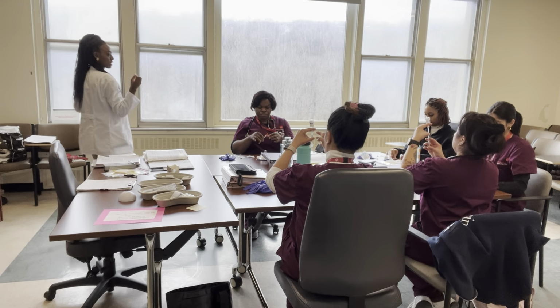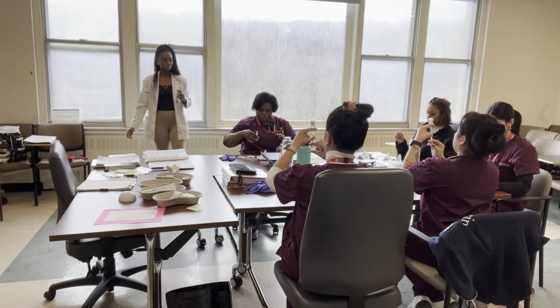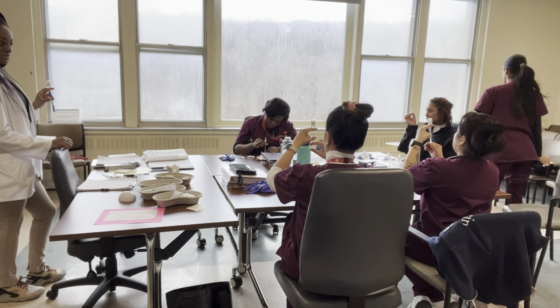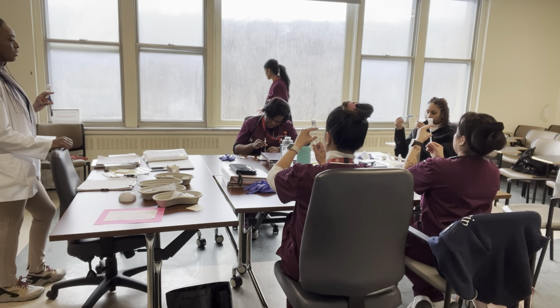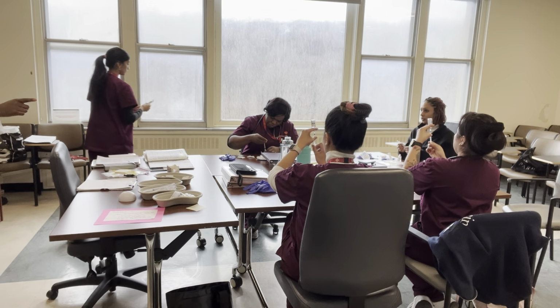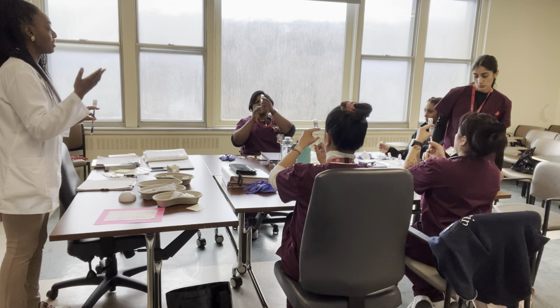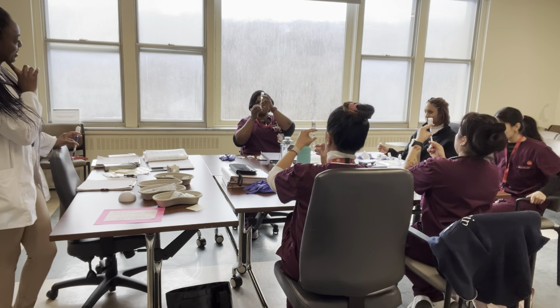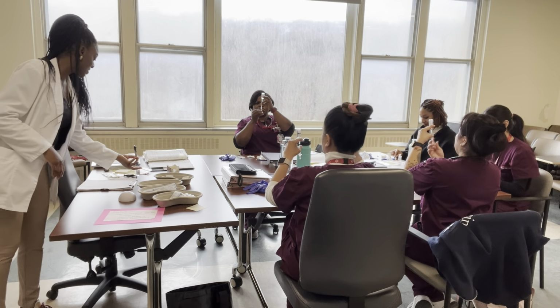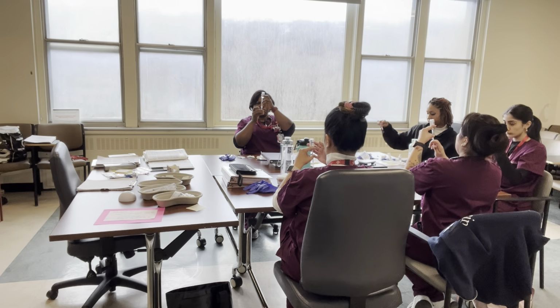So again, you'll practice the walking with it, and you put it away here. When you're done, leave it inside, darling. Remember, I have to verify. Anna had to verify it, because now it doesn't count. You could have taken it from any vial. Now you dropped it. Can you reuse the needle when you've dropped it? It's no longer viable. Let's get you another syringe. I'll be with you in a moment. I'm going to get another syringe.